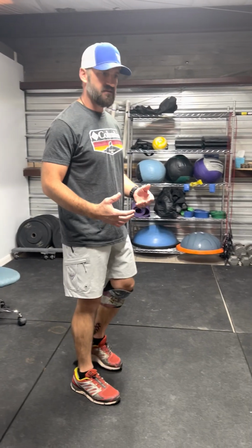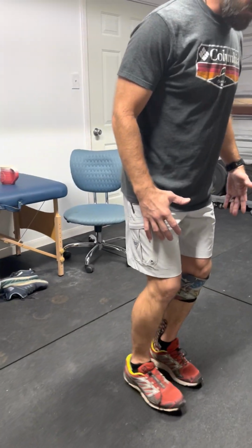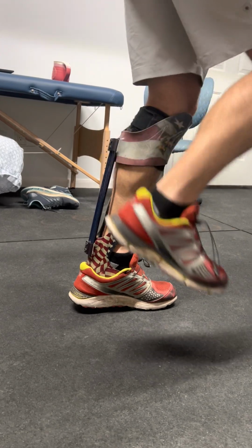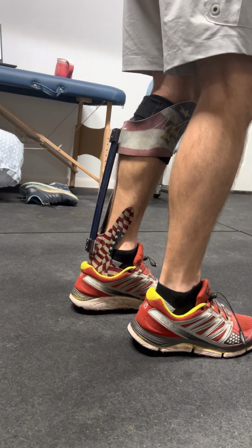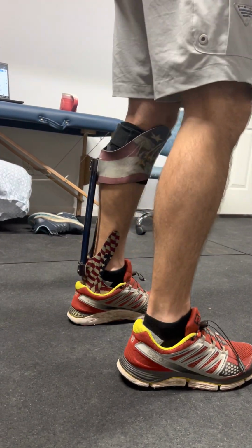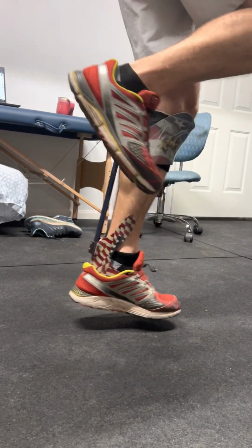Now for high impact activities, the weight's most likely going to be transferred through your forefoot. So I'm standing on my forefoot now, and you can see more of it's going to go through the strut. You can see my strut's bending when I'm doing that. When I'm picking that foot up, the strut will bend, and I just hold myself there. So jump or do something. And so now more high impact is like, so if I'm jumping, it goes there. See that?